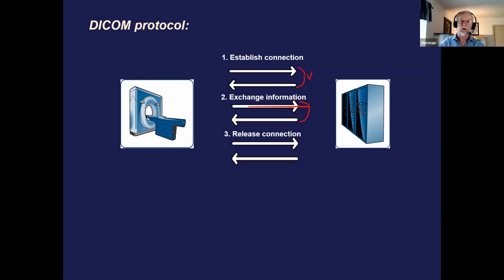Then either it's going to work or it's not going to work. You might get too little or too much, or hopefully you get exactly what you need. We'll talk about how to set the filters to get exactly what you need. And then we release the connection.